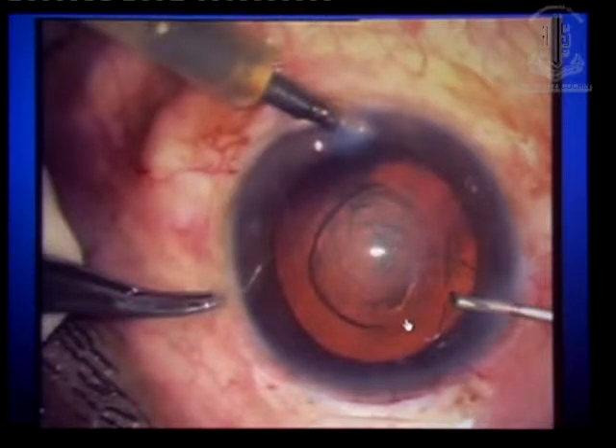You will see so many small catch areas — teeth-like irregularities. So don't do that. Catch the folded portion, catch that folded portion and rotate centripetally. Rotate centripetally and you will see an excellent smooth CCC just by folding it — you will get a very good REXIS.